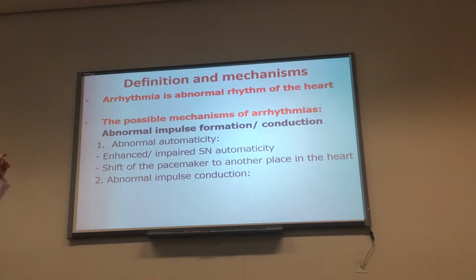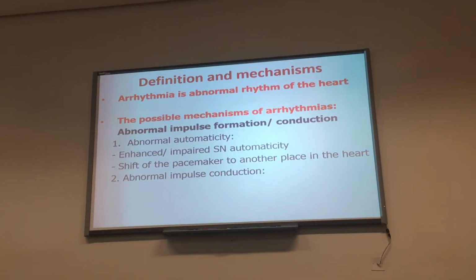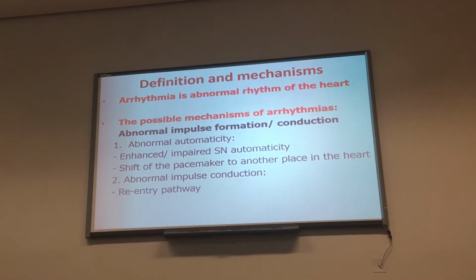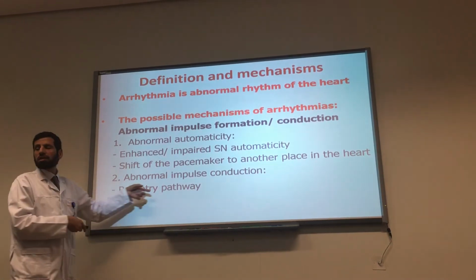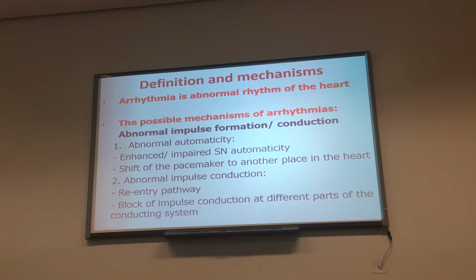Right and left bundle branch blocks, we'll discuss them this week, but they actually do not cause bradycardia because the rate will be the same. It is an ECG feature that you need to recognize, but it does not cause tachy or brady. But the main thing is re-entry. The commonest mechanism of any arrhythmia is re-entry, and re-entry causes tachycardia, not bradycardia. We'll discuss it also in the clinical lectures.